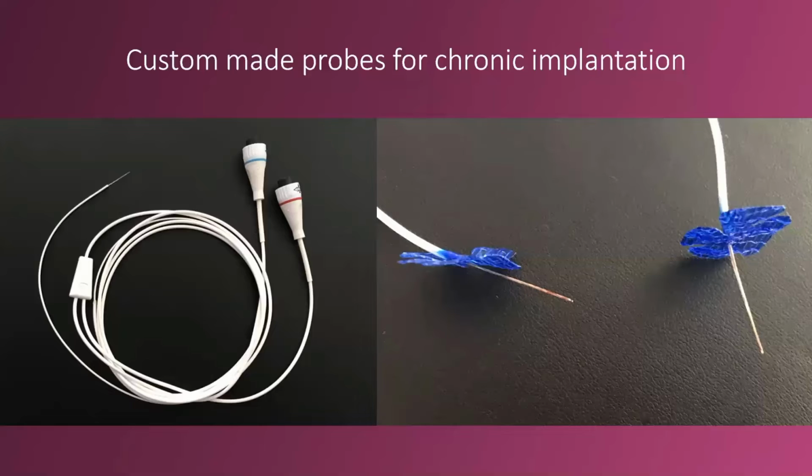So we asked them to make a different kind of probe that consisted of just the outer sheath with 20 millimeters of the fiber optic protruding from that. And on the right, you can see this in more detail. What we've done is we've made a PVC piece of sheeting with gauze for strengthening, and we actually glue that to the two probes, and this enables us to then stick that onto the tissue of interest, and they stay in there firmly. You can see that one of the probes is fitted with the sheet at a right angle to it, and the other at an acute angle.